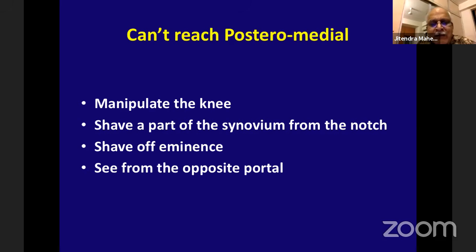I even sometimes shave off the eminence, the tibial eminence, with the help of a burr. That's not important. I want to enter there. I want to create more space. Sometimes I use an RF probe to create a kind of round burn, very carefully saving my PCL. And I create a lot of space.